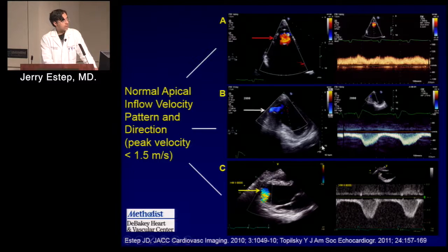You know, this is a continuous flow pump, but what we appreciate is that with ventricular systole, there's contribution made by the LV into the pump. The continuous flow is this background diastolic flow. You appreciate that, right? And so here the diastolic flows here. This is the peak flow influenced by the contribution of the LV. So in those patients that have acquired aortic root clot or left main clot, and the LV is not contracting, and they're 100% LVAD dependent, you lose the pulsatility. Is that because of a lack of contribution from the LV?